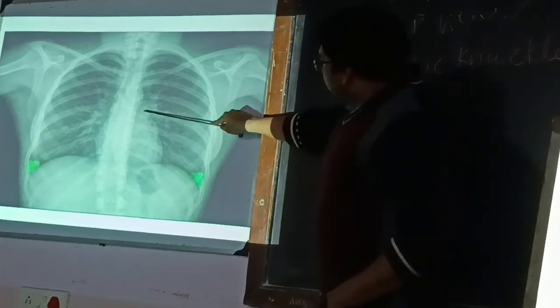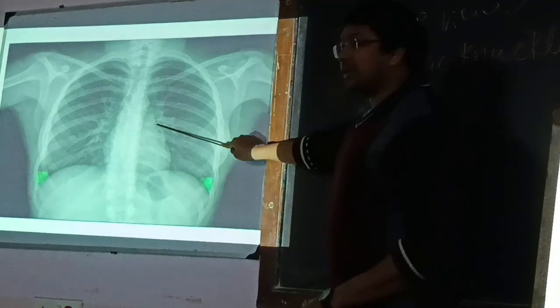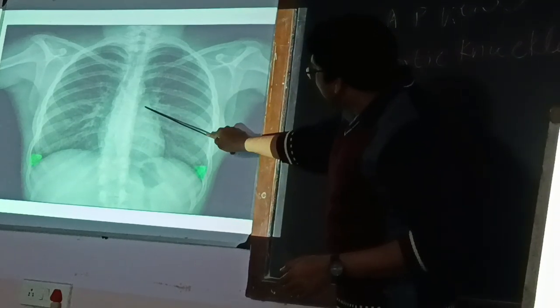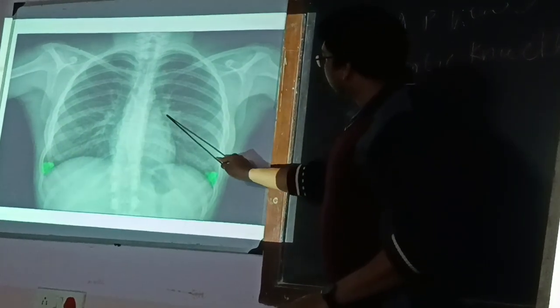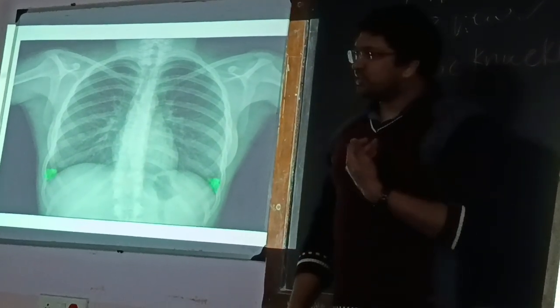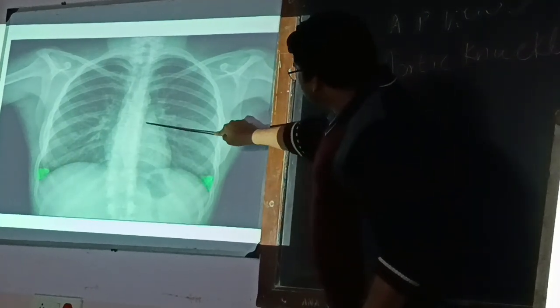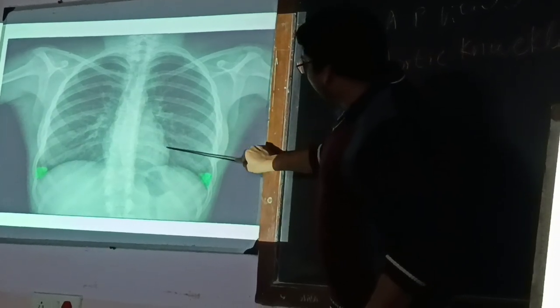Okay. So just adjacent to the pulmonary trunk, you can get the left auricle, because the left atrium is behind, we can't get it over here. Whatever we are getting over here is the left auricle just below the pulmonary trunk, because adjacent to the pulmonary trunk lies the left auricle. Left auricle is associated with the pulmonary trunk, right auricle with the ascending aorta. Is it not right? So among this entire concavity over here, this is the left ventricle.